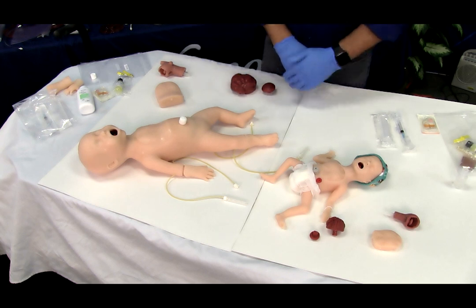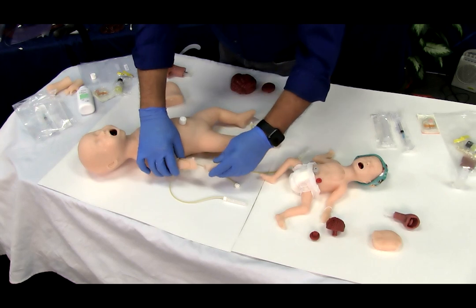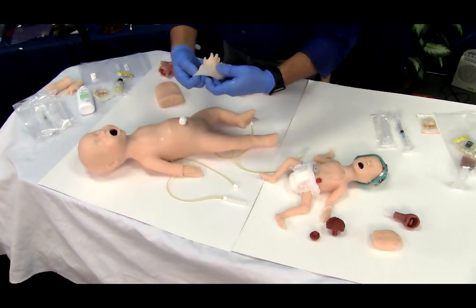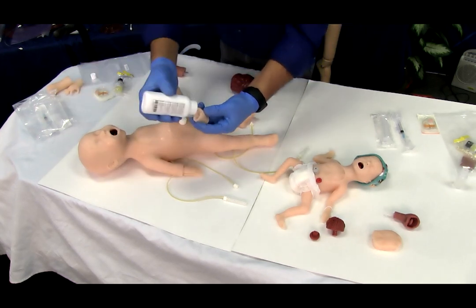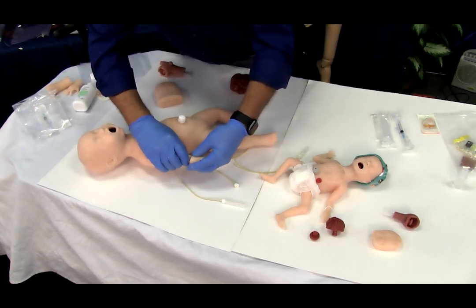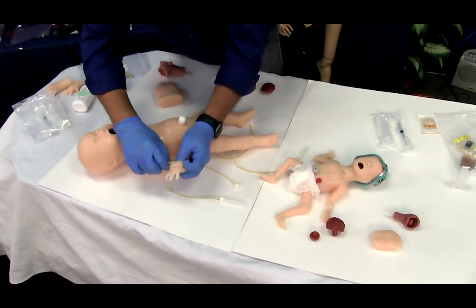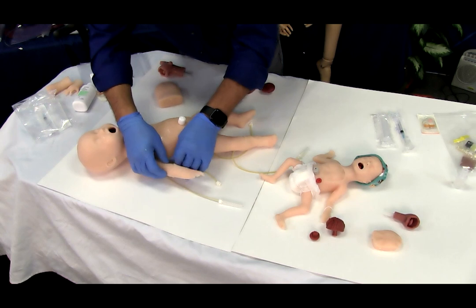To apply the IV hand and foot skin, you'll generously powder the inside of the hand skin and carefully pull the skin over the hand, taking care not to dislodge the vein tubing. You'll follow the same procedure for the foot.